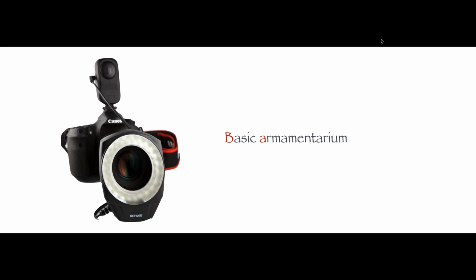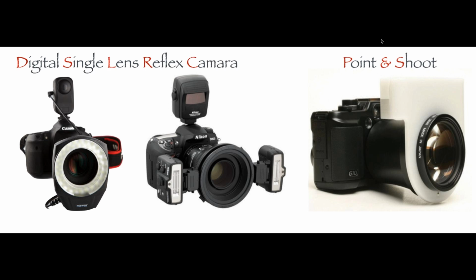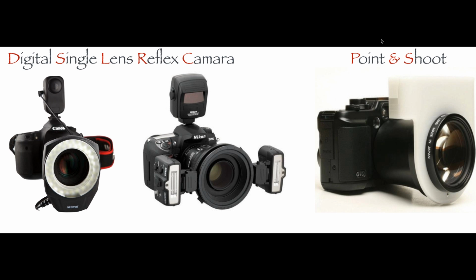So now we're going to talk about the basic armamentarium that we need in order to obtain photos of the quality that you just saw. I want you to relate to that, because there are many cameras out there that can be used for dental photography, but that doesn't mean that the simpler cameras are going to give you the opportunity to achieve the exact same results. That's something you have to keep in mind.